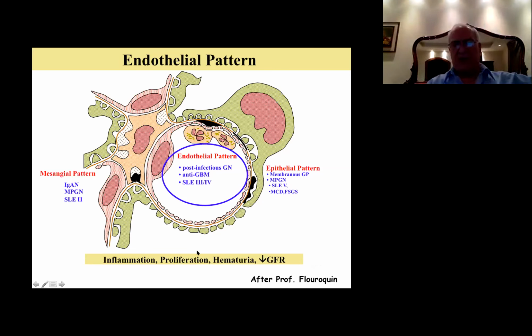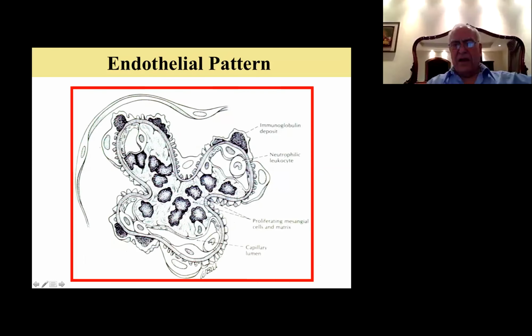Sketch presentation, epithelial part looks perfect, basement membrane looks perfect, but look at this. It's a bloodless glomerulus. Marked inflammation and mesangial cells, endothelial cell proliferation, pressing the capillary lumen to the point that there is very little blood to percolate through. And not only that, you start seeing humps, subepithelial humps that you see. This is classically, you can see it with post-infectious.